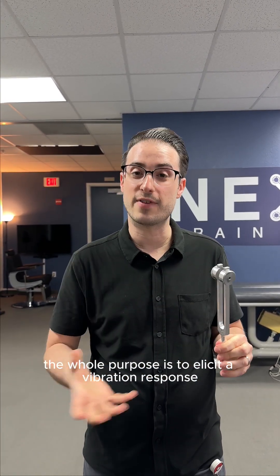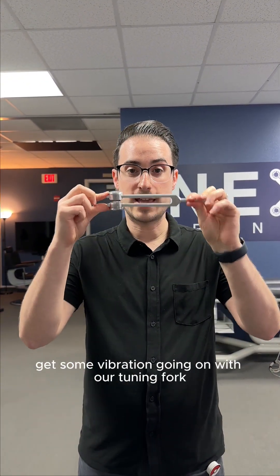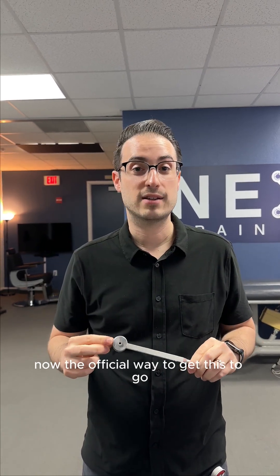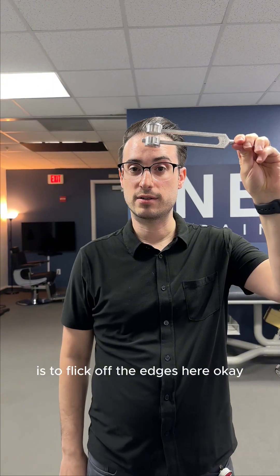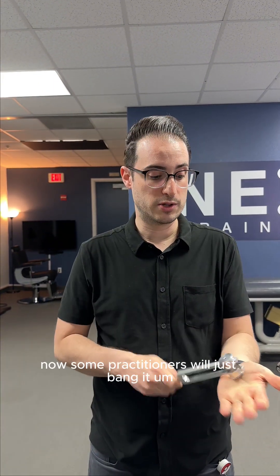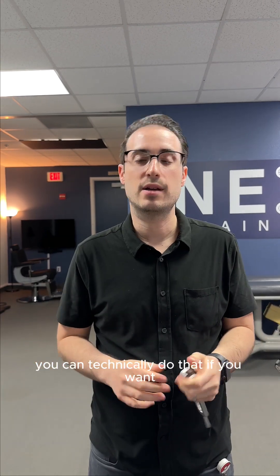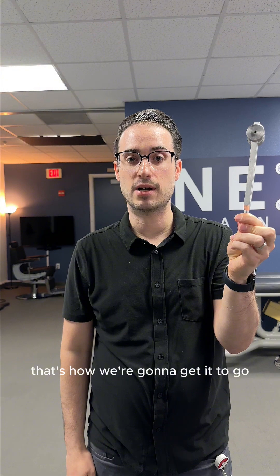The whole purpose is to elicit a vibration response that the patient can tell you is comparative from side to side. To get the tuning fork going, the official way is to flick off the edges. Some practitioners will just bang it — you can technically do that — but if we want to be as consistent as possible, we're going to just flick it like this.